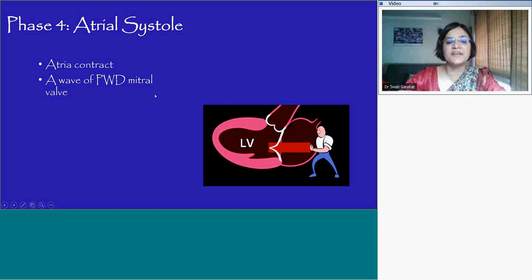The atrial systole is when the atria contract and push blood into the ventricle. This part of ventricular diastole has to do with how compliant the ventricle is. In diastolic dysfunction, relaxation is impacted first. Remember, first the IVRT, and then the peak A on the mitral valve pulse Doppler, that's the part which is impacted first in ventricular diastolic dysfunction.